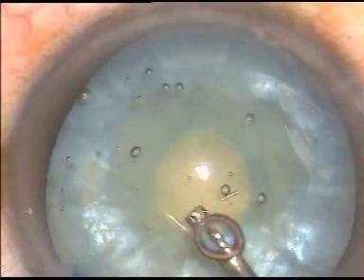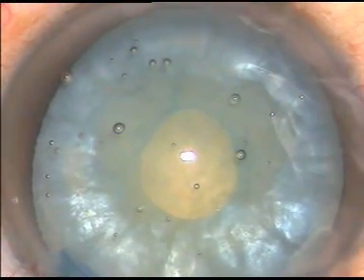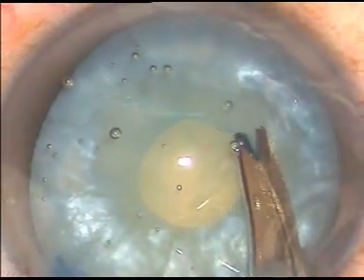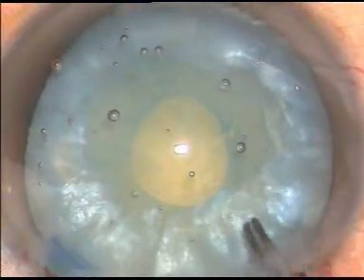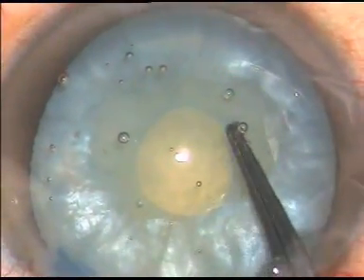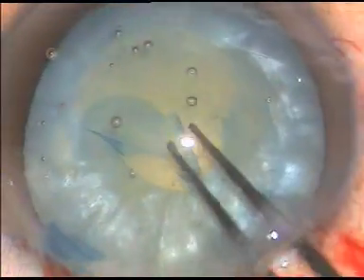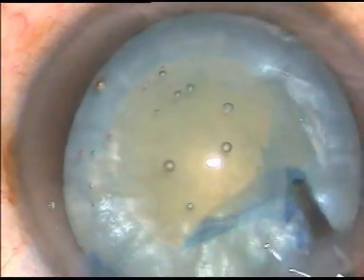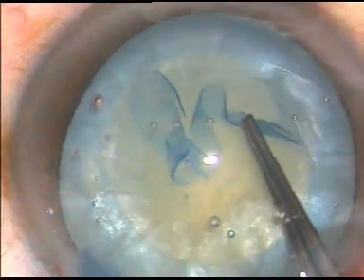Viscoelastic substance is then injected into the anterior chamber. A Vannas scissor is taken and a small cut is given at around 9 o'clock. Now the capsule-holding forceps is taken and a bigger rhexis is done — I go in the anti-clockwise direction.